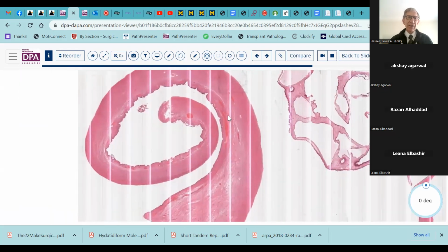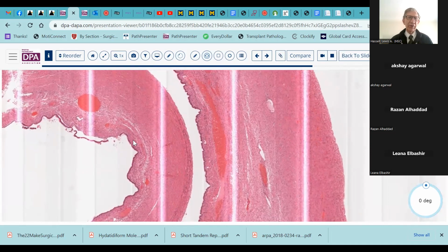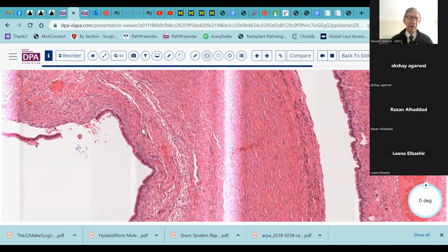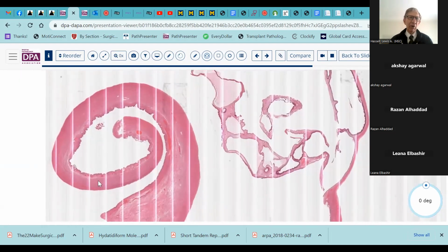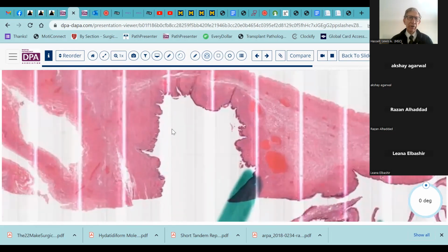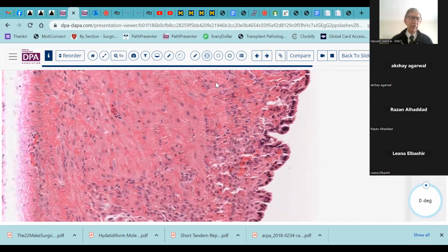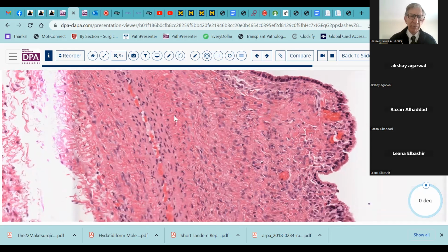So then looking at this other component over here, we noticed that there was maybe a little bit of mucinous epithelium here. Actually looking at this now, this looks like it may actually be more ovarian here. So I think we have a little bit of ovary with possibly a mucinous cystadenoma. We have a little bit of fallopian tube here, which does have the smooth muscle, I believe. Am I right here? Or am I just pulling your leg?